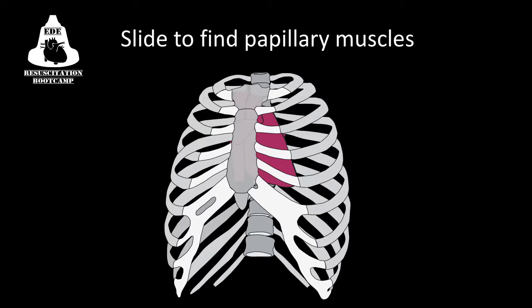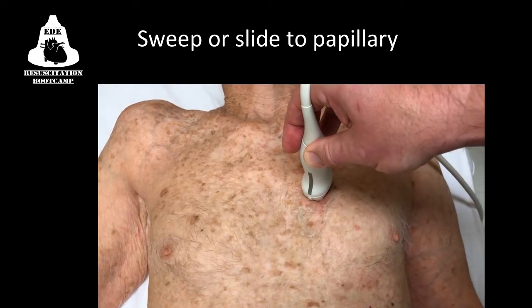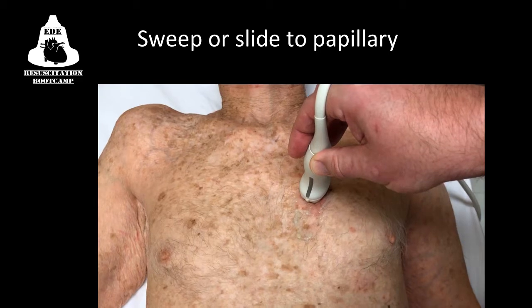As you sweep to find the papillary muscles, the image may become too distorted. It can be worth trying a small slide in the plane of the long axis of the heart instead. This move will be limited by the lung, but can generate a superior image in some patients. Here we see the operator sweep to find the papillary level and then try a little sliding. Note that these are normally very small motions.